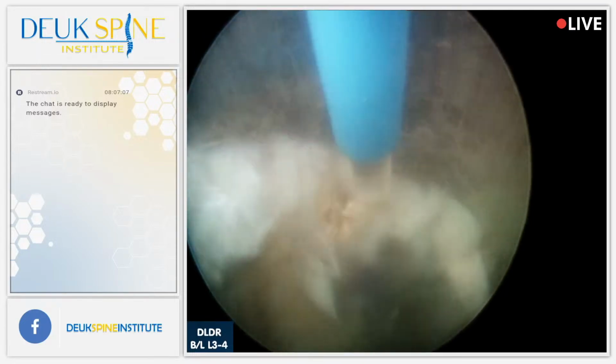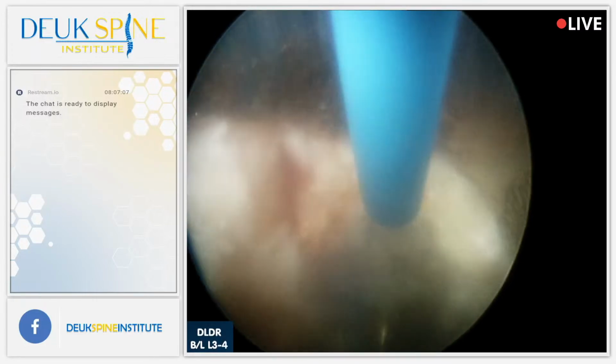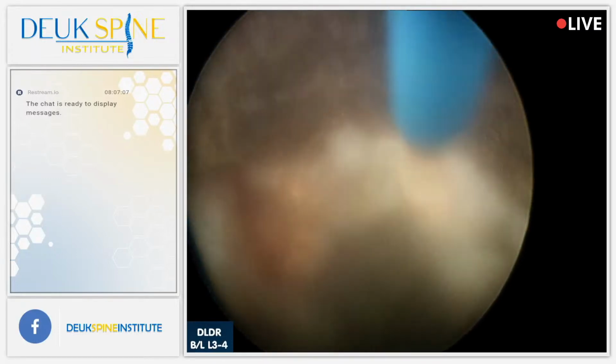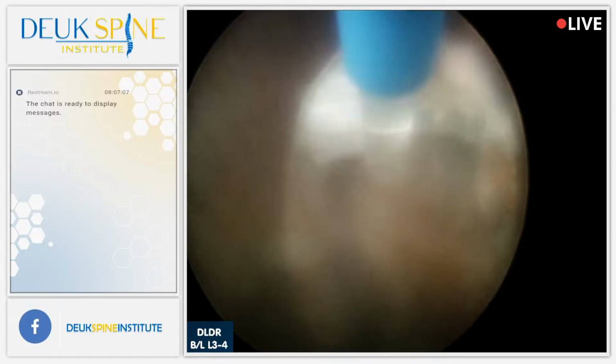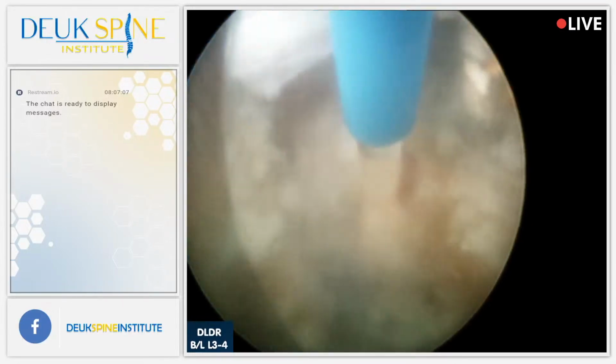We have a question. Sure. If there were dolphins swimming around in here or whales, this sound wave would be communicating to them. That's how powerful it is. But what it does is it creates a shaking or a mechanical agitation, and it really helps with the surgery to get the loose pieces of herniation out.